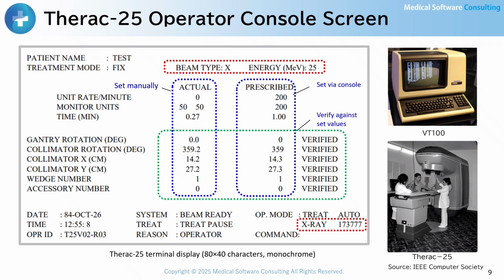After the overdose accident, Dr. Hager at the Tyler Clinic and the Therac 25 operator worked late into the night and finally discovered the exact conditions under which the fatal Malfunction 54 occurred. It was triggered by the speed at which a particular sequence of commands was entered. The operator, who had been working with the machine for quite some time, was highly experienced and entered data at a very fast pace. She quickly typed in the treatment parameters and, when necessary, used the built-in editing function of the Therac 25 to make corrections.